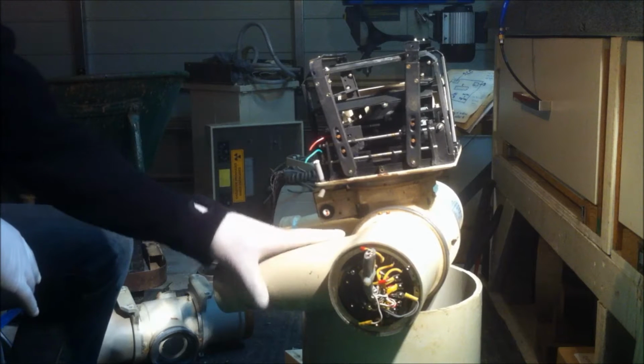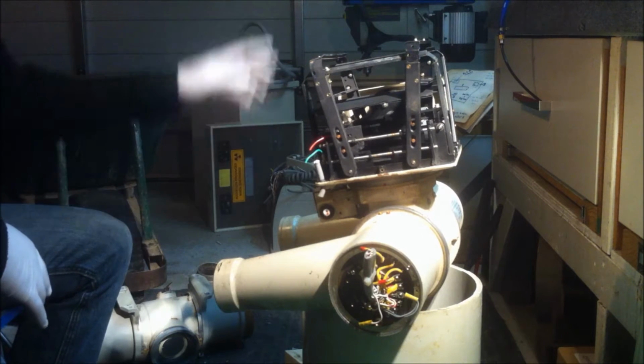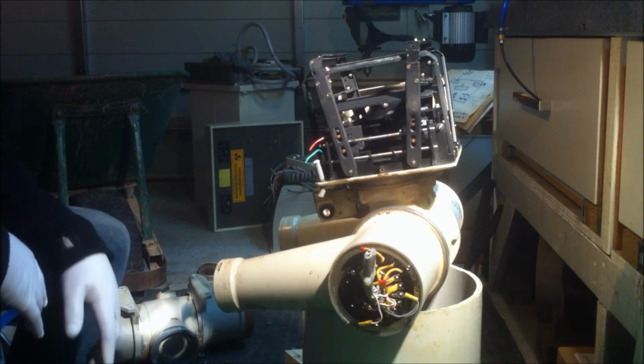So let's cut through the fat. I'll take some parts off of this, get the oil out, and do the same with the other one. Put all the parts up on the bench and take a closer look. Let's get into it.